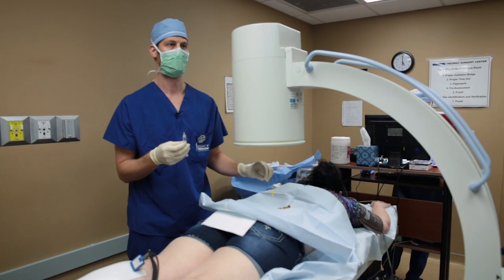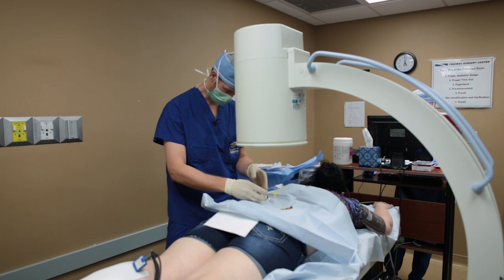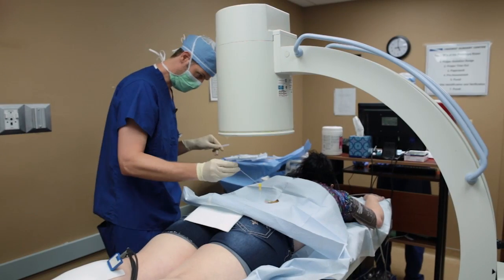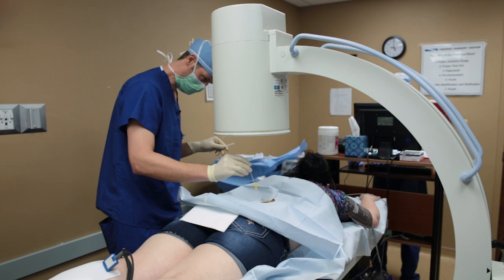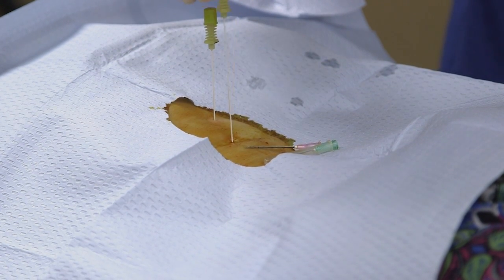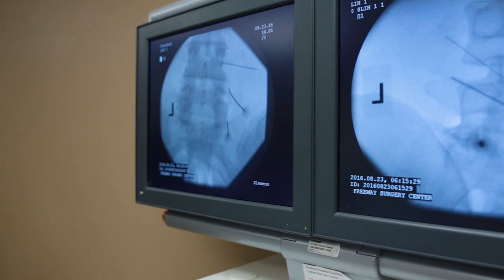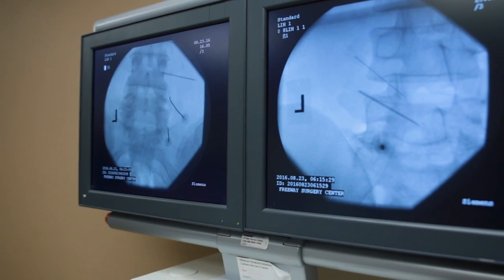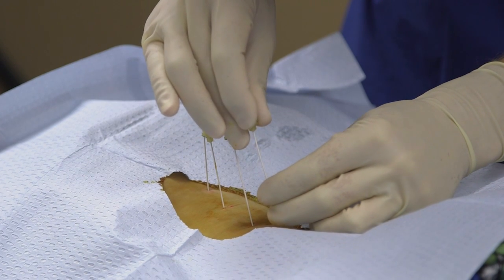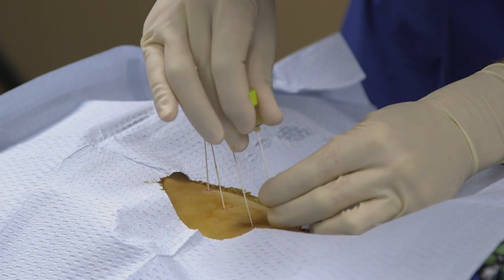Now we're going to move on to the next level and place a little more numbing medication — a little poke and a sting. In most cases we'll be placing four needles, and that will help us destroy the little nerves that go to the three different joints, usually in the lower lumbar spine, that are under the most pressure and most likely causing your pain.